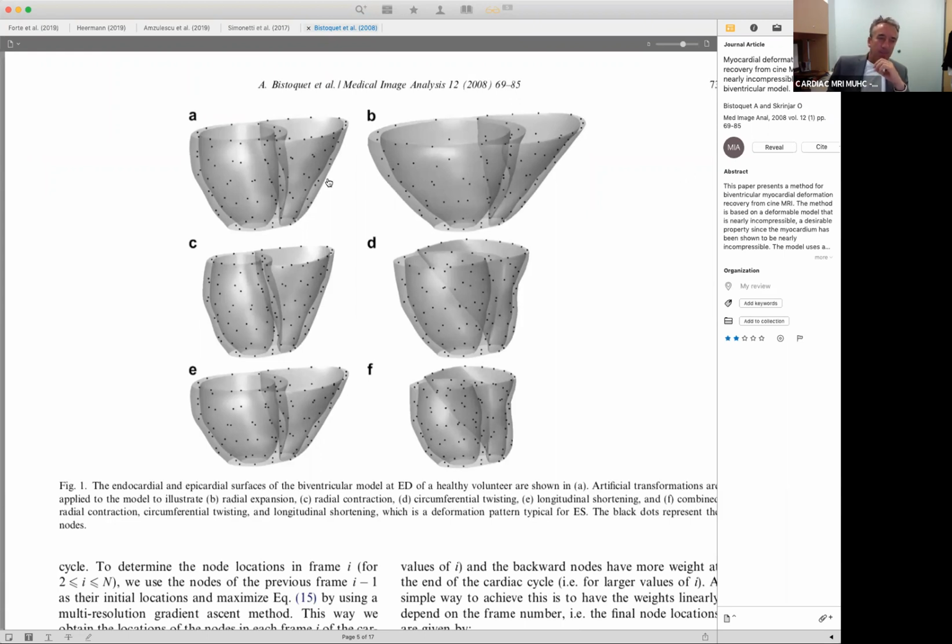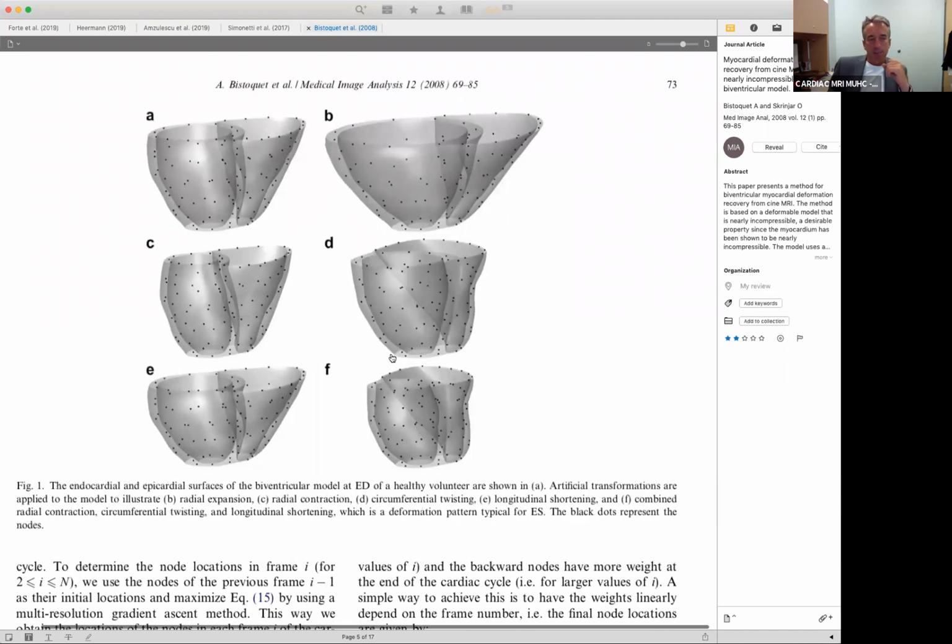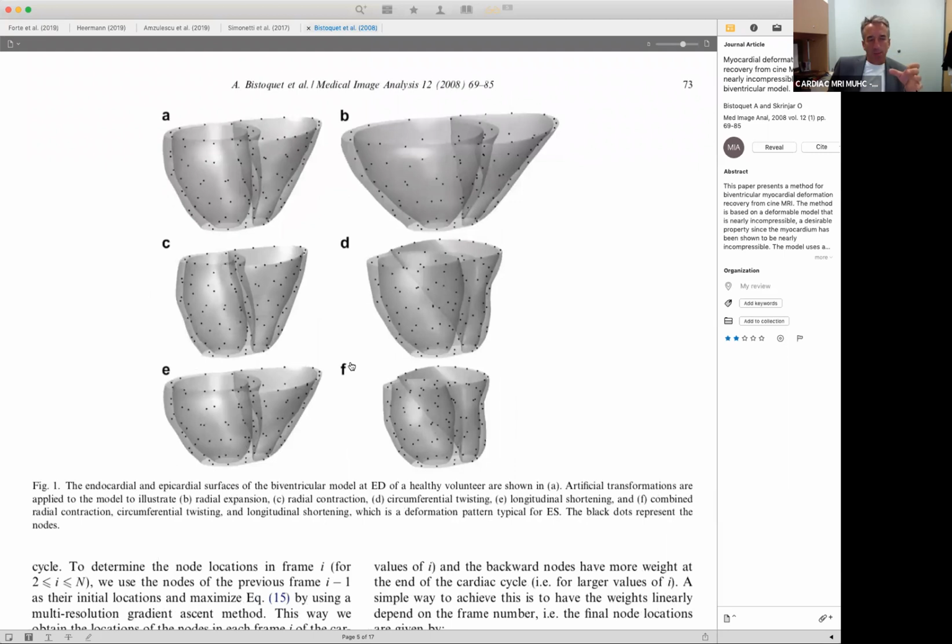Thank you. So that in systole and diastole, anatomical landmarks are used based on the contours, and then using the assumption that the heart itself, the myocardium, cannot be compressed significantly, the shape has to go from this to this, and so these are the three different examples on how you can assess that.